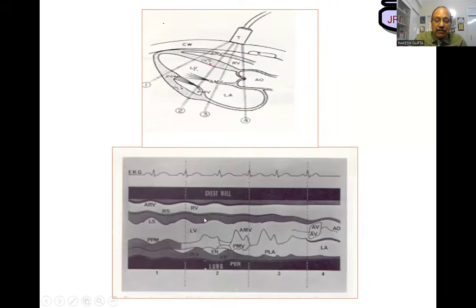This is endocardium; I'm not bothered about endocardium. So look at this small thickness over here. This becomes leading edge and this becomes trailing edge. And that's how, if I'm doing my M mode measurements from here, this is the leading edge of the LA. This is the trailing edge of the LA. If I'm doing 2 dimensional echo, this will become trailing edge to leading edge, which will come back again and again.